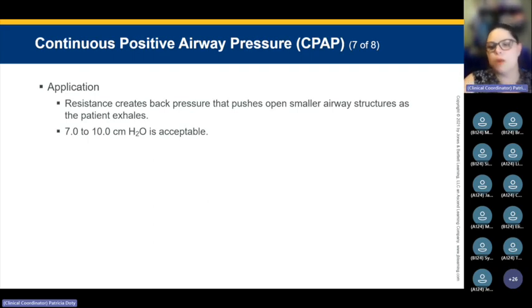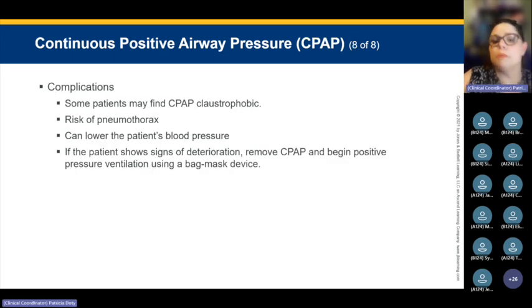Most CPAP units are powered by oxygen, so it's important to have a full oxygen cylinder when using CPAP, and I promise you, you will run out of oxygen quicker than you think using a CPAP. So go and follow Skill Drill 11-9 to learn a little bit more.